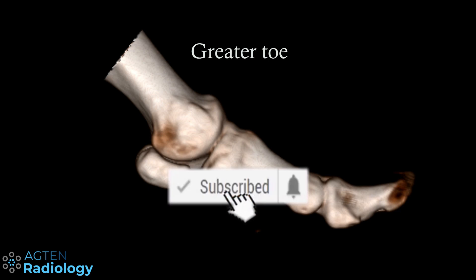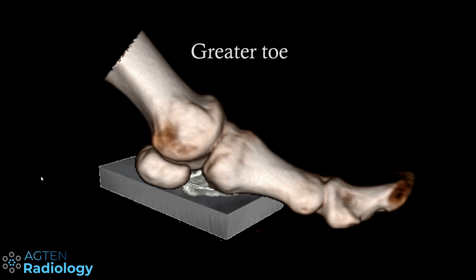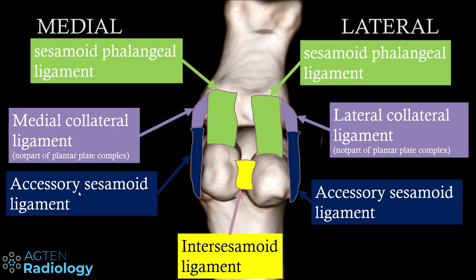When you start out with MSK and you have a great toe and the query is plantar plate tear, typically you just deal with the plantar plate as one structure — at least I did in the beginning, and it's a little bit more tricky than that. The plantar plate complex is a collection of different structures that are all supporting the plantar aspect of the metatarsophalangeal joint, helping to distribute forces. It's not just one structure, and that's very important to understand. The goal today is to show you that you should be able to call these different structures out and say where the pathology actually is.